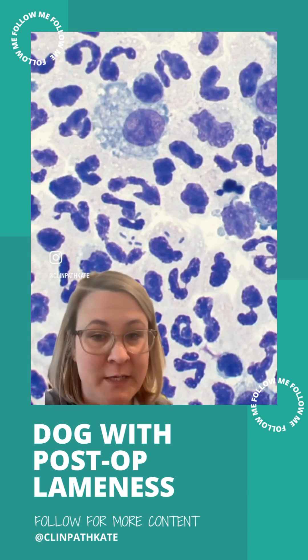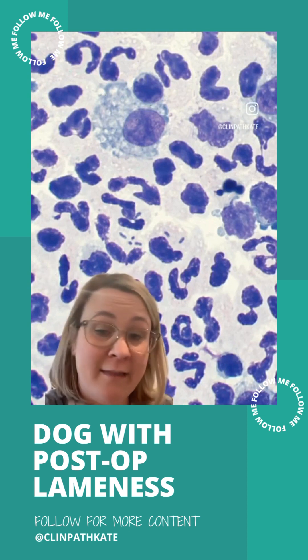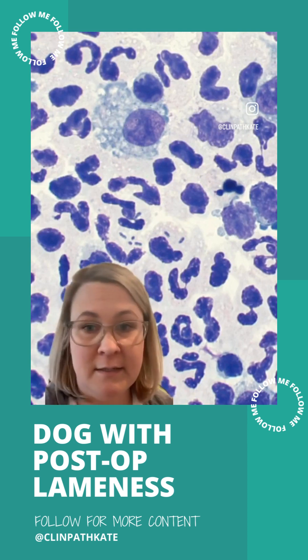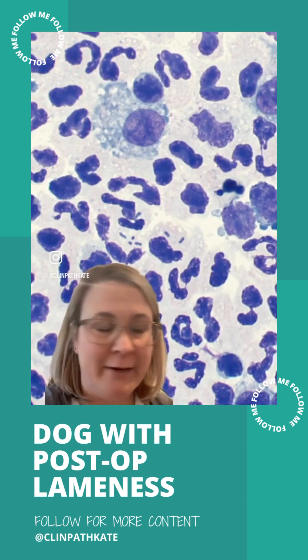Not a good situation. After talking to the owners more, the veterinarian found out that they had not been diligent about keeping the e-collar on this dog. It had been licking this incision since it had its surgery, and that was the impetus for this septic process happening here.